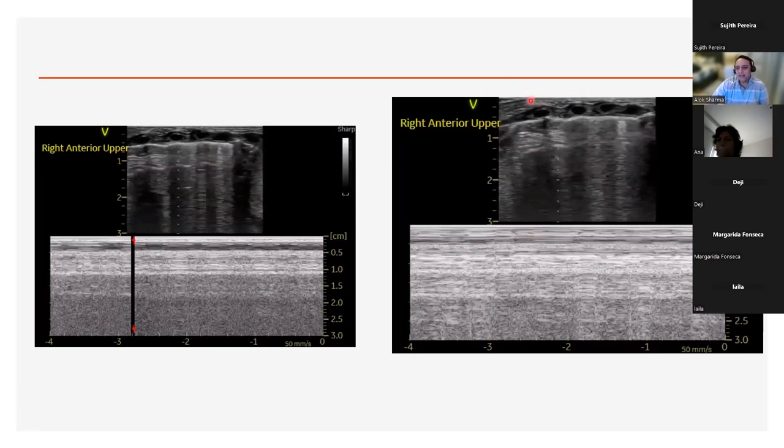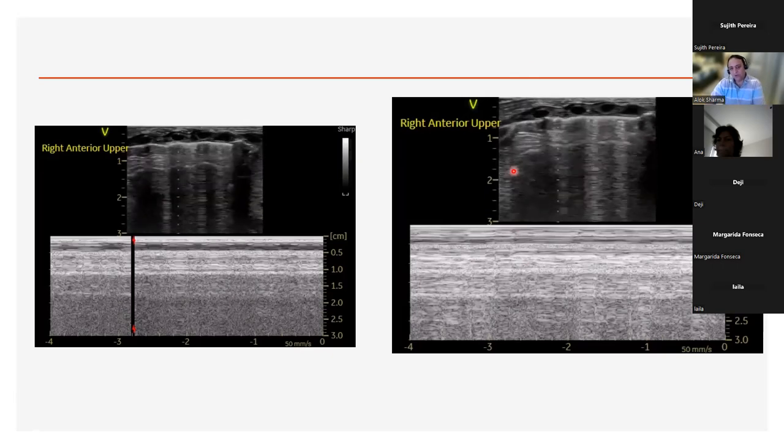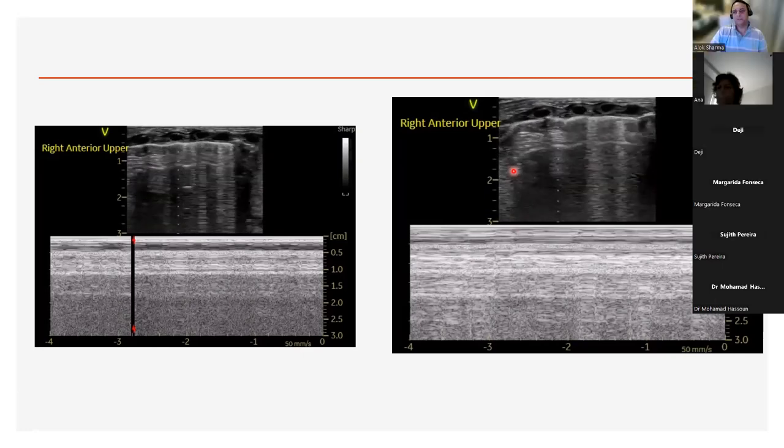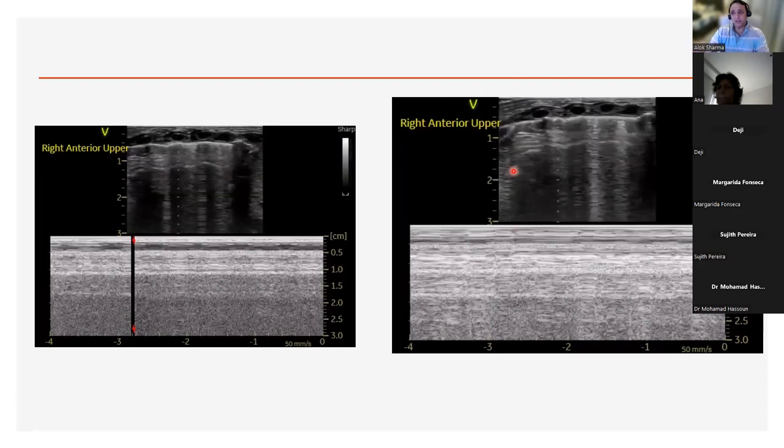And that's how you quantify a pneumothorax. If you have R1 going right up to R4, that's a pretty large air leak. Now, just really important, guys, tension pneumothorax is a clinical diagnosis. You do not define tension pneumothoraces on X-ray or lung ultrasound. If you have weak pulses, you're not saturating and you're bradycardic, that is a tension pneumothorax. If that's what you think clinically, you transilluminate, there's reduced air entry. So it is not a diagnosis that you make on a chest x-ray or lung ultrasound.